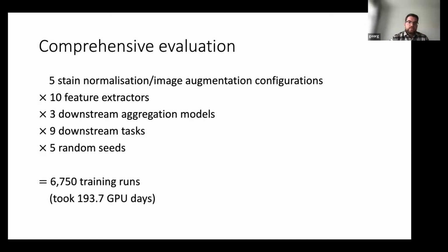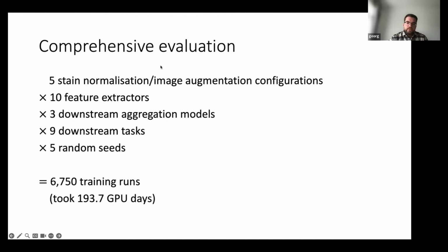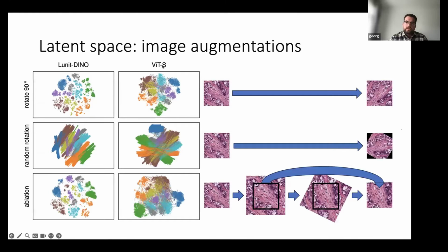Yeah, so they use different augmentations because, well, first of all, we used ImageNet, the ViT-S model we used was not pre-trained with self-supervised learning, just supervised on the ImageNet labels. So there's like 1,000 classes, and they've used different augmentations during training than Dino, of course. Okay.